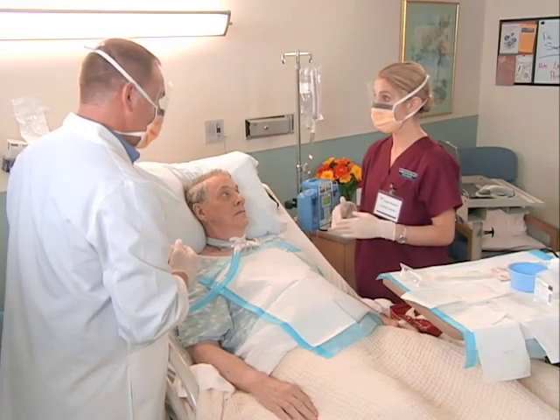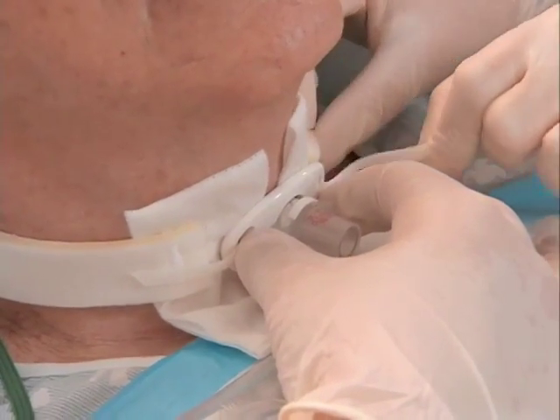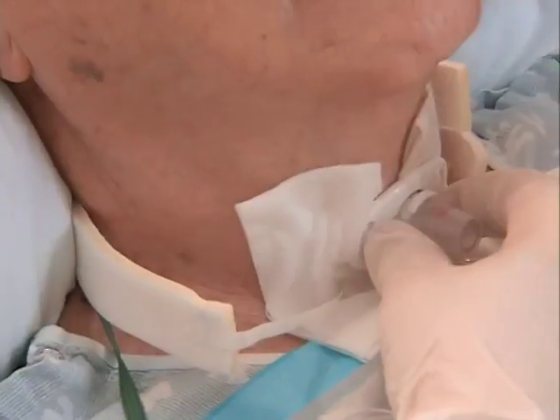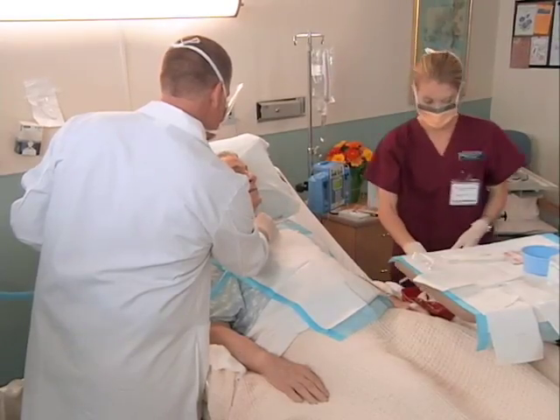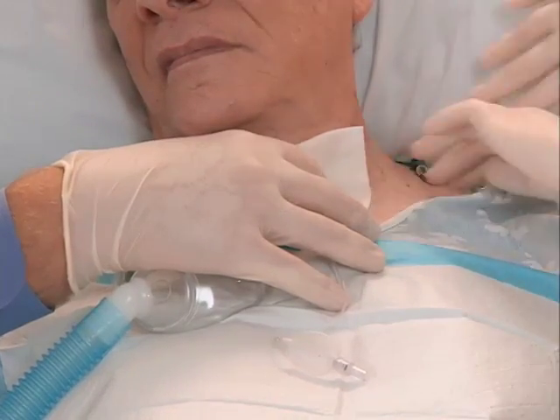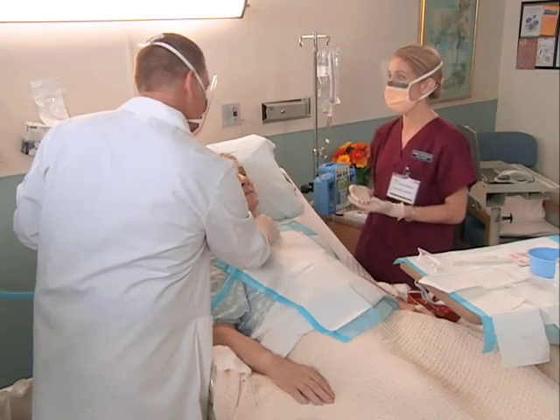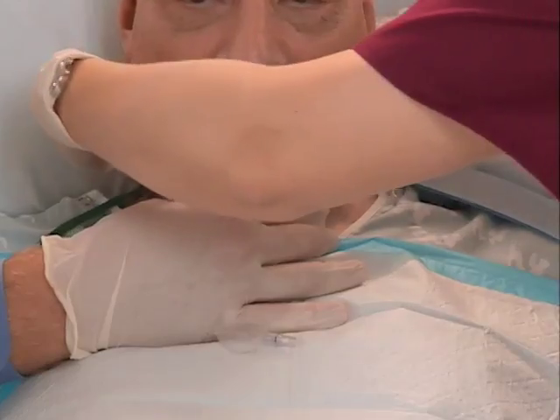You hold the faceplate while I pull up the Velcro tabs and gently remove the collar. Can you turn your head? I don't see any skin breakdown on the posterior portion of the neck. Do you see anything, Mr. McDaniel? Nope. Now that could happen if there were any irritation or pressure from the tracheostomy holder. That's right, Marissa. Great. Now I'll put the collar on the patient's neck and insert the tabs.